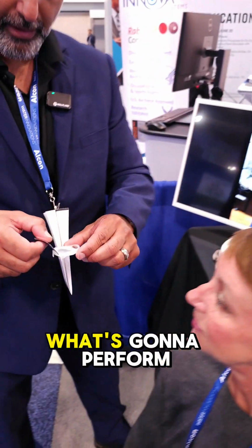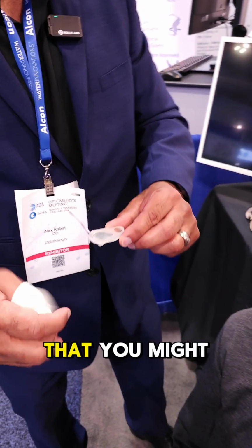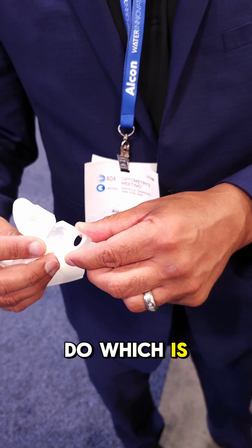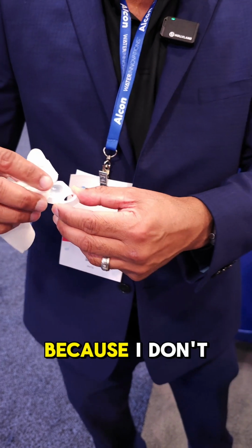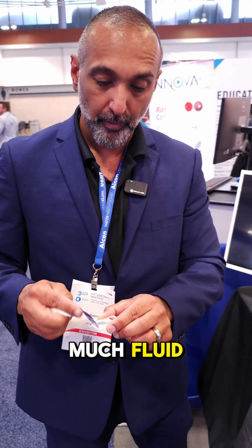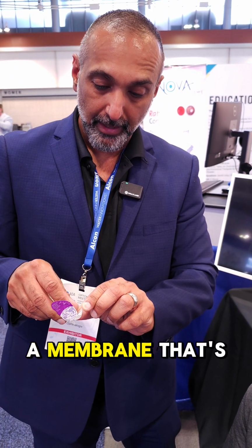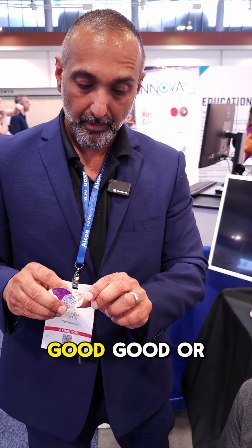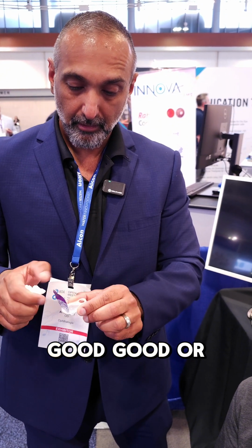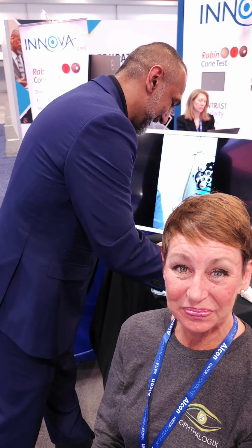Now I have what's going to perform as my bandage lens here. I'm going to do something that you might not see a lot of folks do, which is drain most of the fluid here. And I'm going to do that because I don't want to introduce so much fluid when I place this membrane that I destabilize a membrane that's trying to adhere onto the cornea. Good, good. Or you can just pour it out like that. One way or the other it'll work.